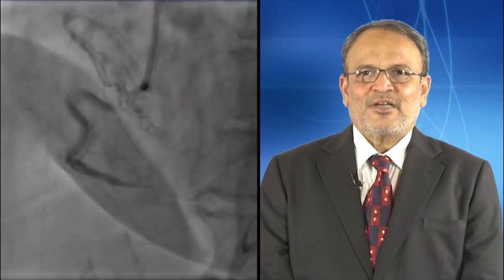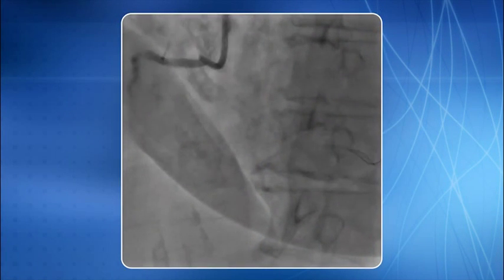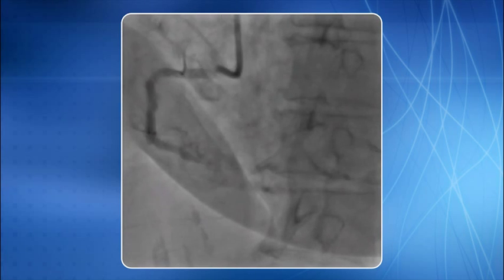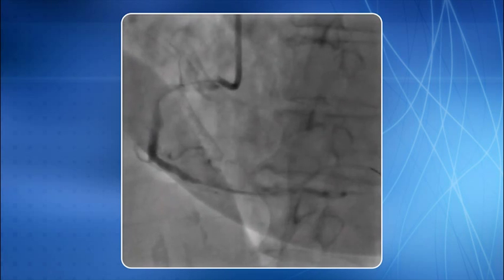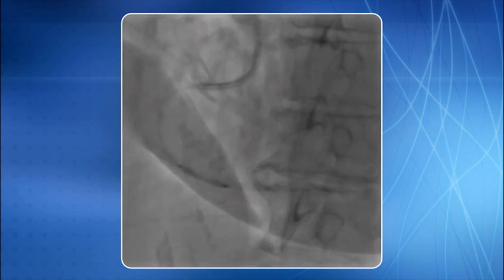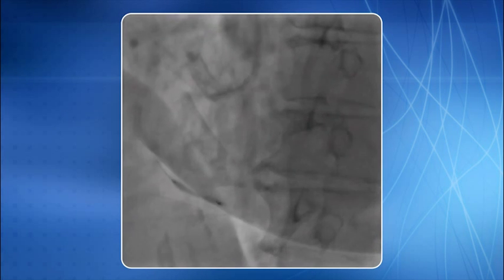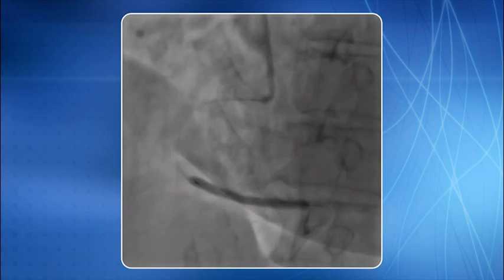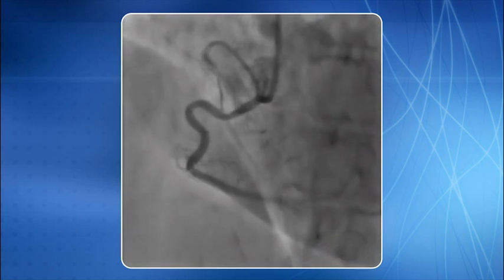Selective RCA injection using a 6F JR4 guide catheter revealed total occlusion with a large thrombus in the mid part. The lesion was crossed using a 0.014 inch Whisper PTCA guide wire. PTCA was done and stenting is in progress — here you see an optimal end result.